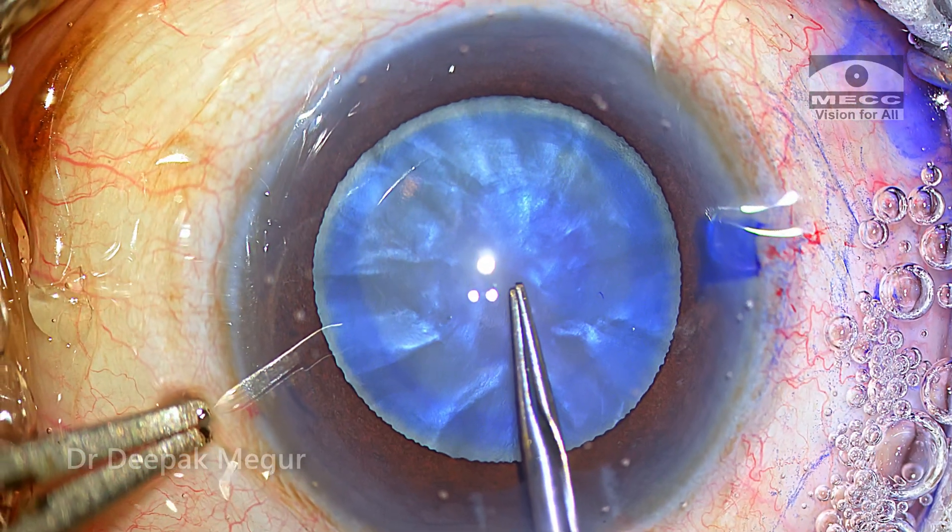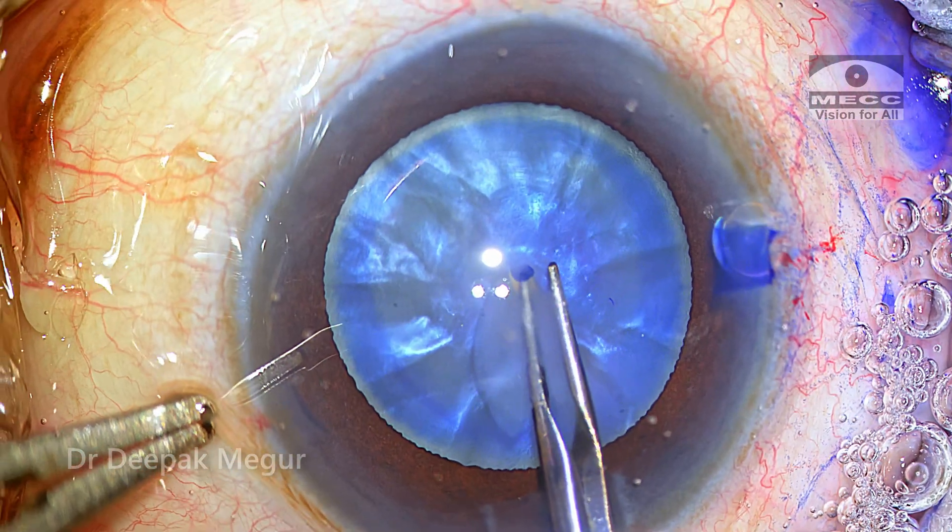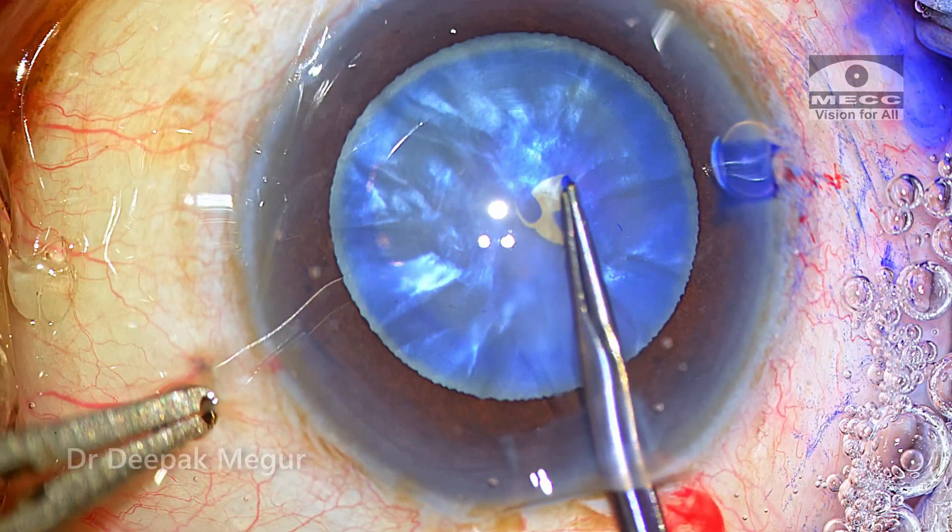The plan is to do a two-stage rhexis. The capsule is first punctured with the forceps itself and then a 3 mm round rhexis is created.